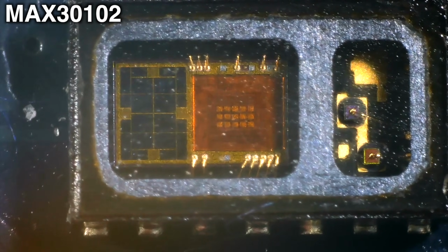So I'll just plug in the module. So I've got it powered on. Now you can easily see the red LED, but if I cover this up slightly and just move the lights away, you can see a slight glow from the infrared LED. So the camera on my microscope is picking up the infrared coming out of that LED. So that's pretty interesting to see. Yeah, pretty cool. So let's get it all wired up and see if we can actually make this work.